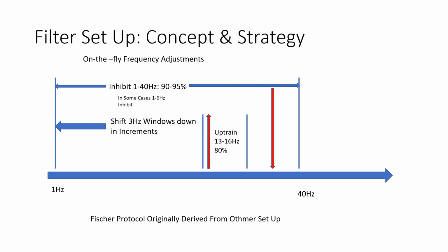But sleep spindles, which SMR basically are, they shift with age. They're down slightly lower. They're down around 12.5 hertz if you're a 4-year-old, maybe 12 hertz if you're 3, and they go up to 15 hertz as adults, but generally they're between 12 and 14 on average. But then if you go frontally, there is sleep spindles frontally, and they're much lower. They go down into 11 and 10 hertz. So location makes a difference, as does shifting your filter.